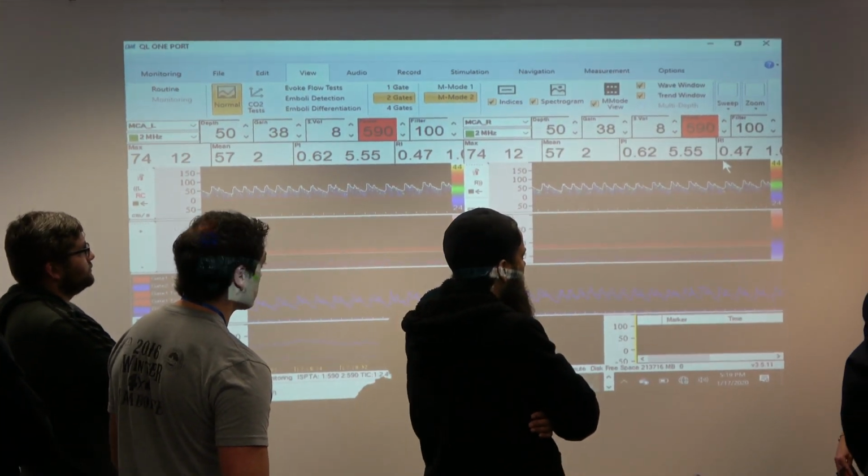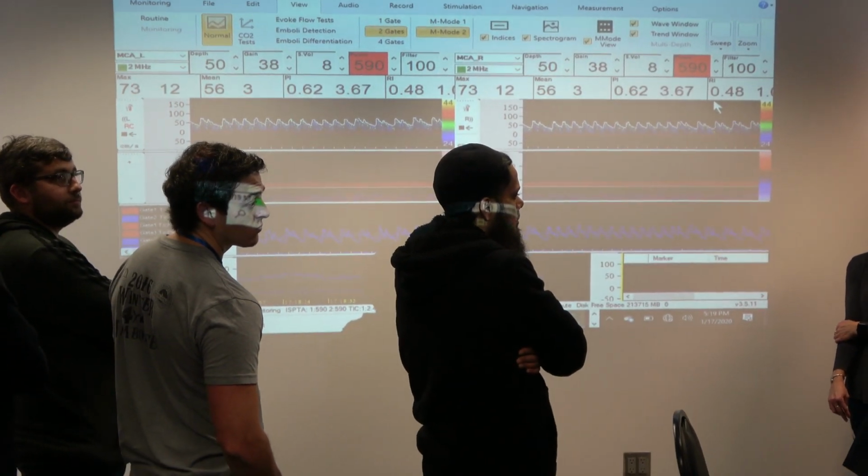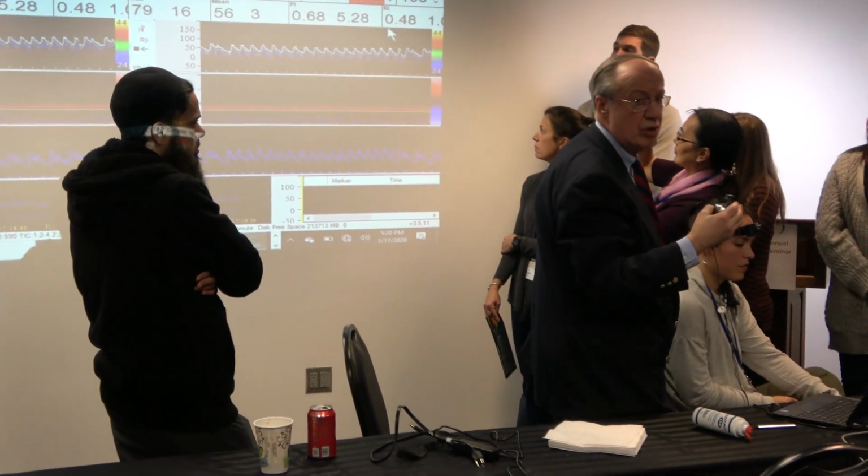And practically that's it during the surgery. You don't need to do anything. You need just to record. All machines, of course, allow you recording, and you can do offline evaluation too.